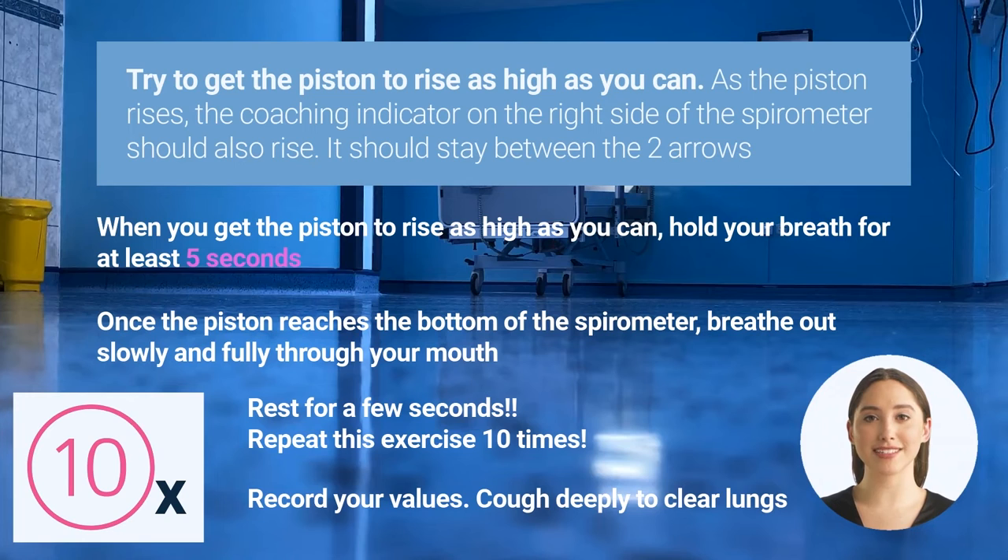If the indicator rises above the higher arrow, you're breathing in too fast — try to breathe in slower. If the indicator stays below the lower arrow, you're breathing in too slow — try to breathe in faster. When you get the piston to rise as high as you can, hold your breath for at least 5 seconds. You will see the piston slowly fall to the bottom of the spirometer.